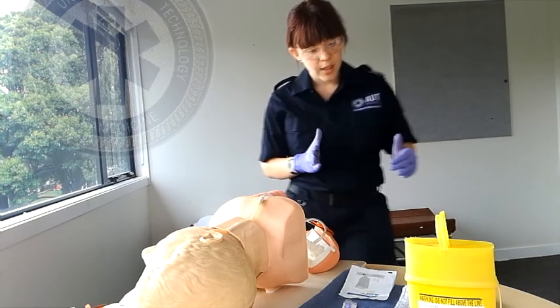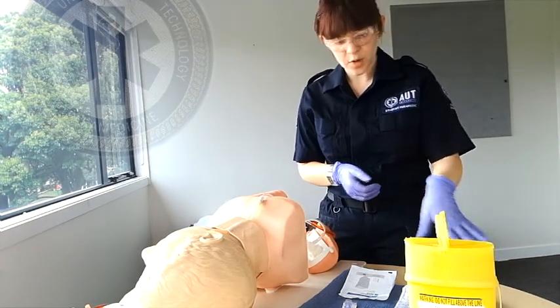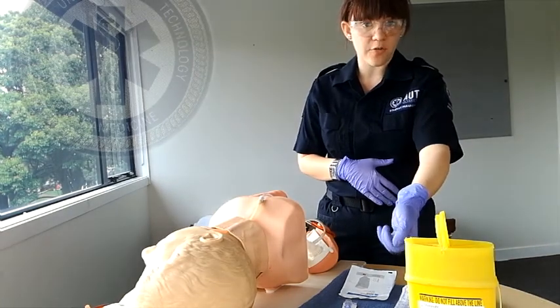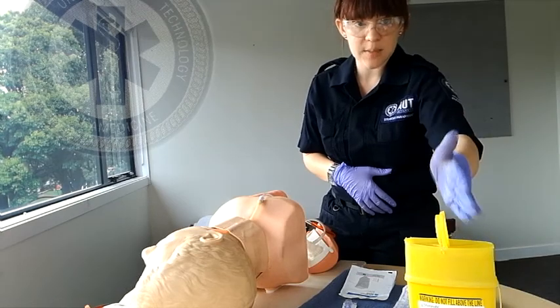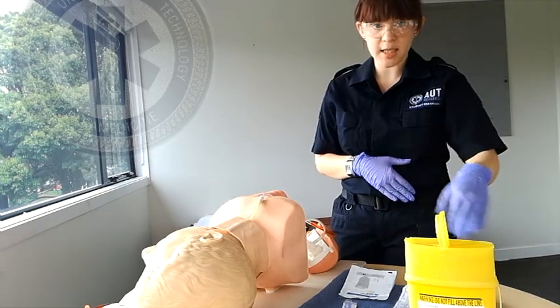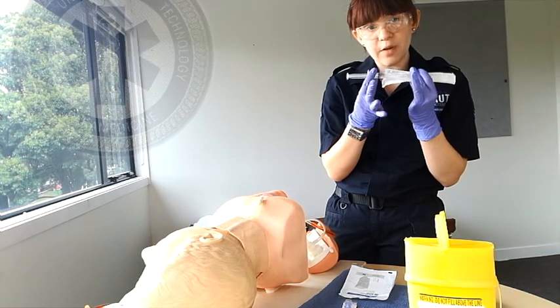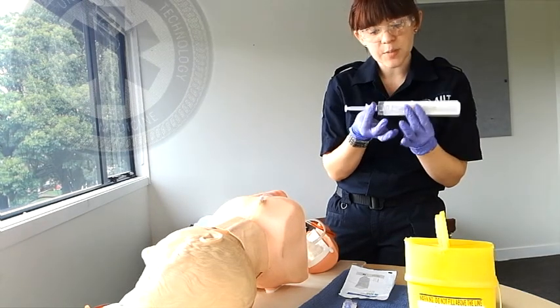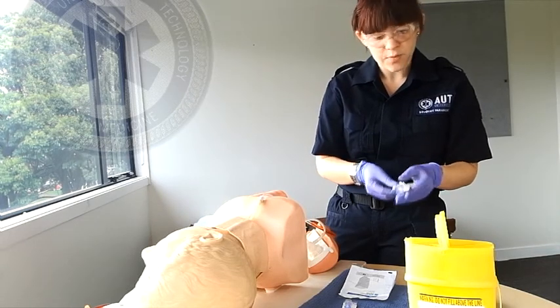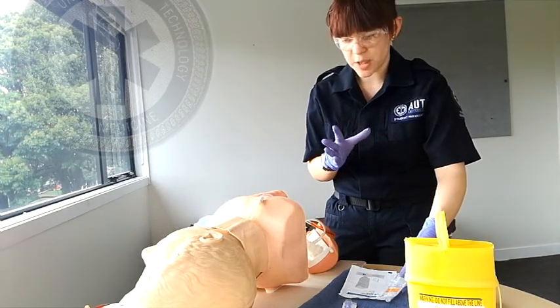I have my equipment out before me: my swab, my alcohol prep pad, my luer, my plug, my tape, some spare sodium chloride for a flush, my Tegaderm, and my sharps bin. My 14-gauge cannula has been attached to a pre-made saline flush. This is to create a closed circuit, which lowers the risk of pneumothorax, air embolisms, and other complications associated with this procedure.